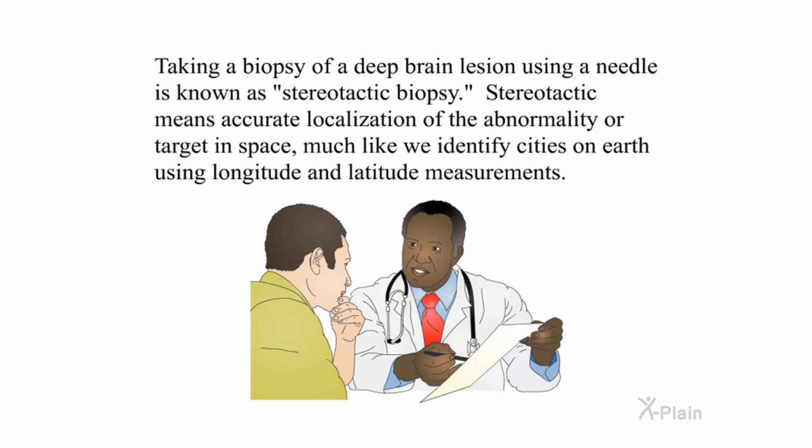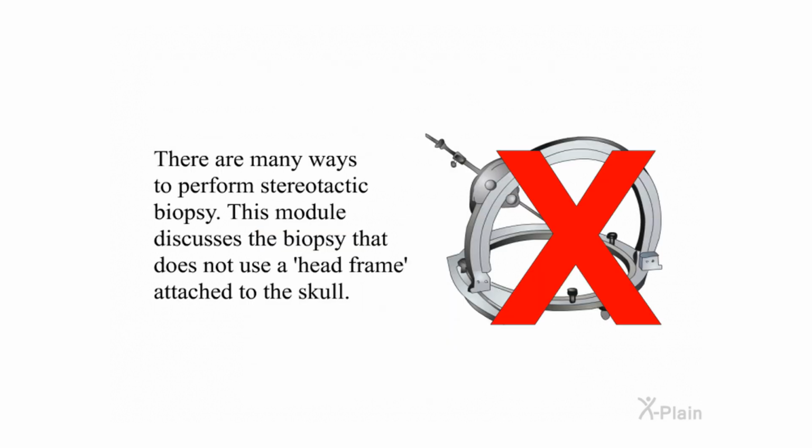Stereotactic means accurate localization of the abnormality or target in space, much like we identify cities on Earth using longitude and latitude measurements. There are many ways to perform stereotactic biopsy. This module discusses the biopsy that does not use a head frame attached to the skull.